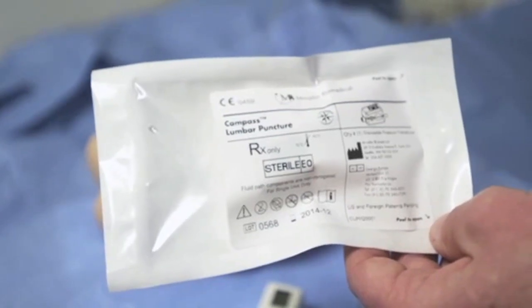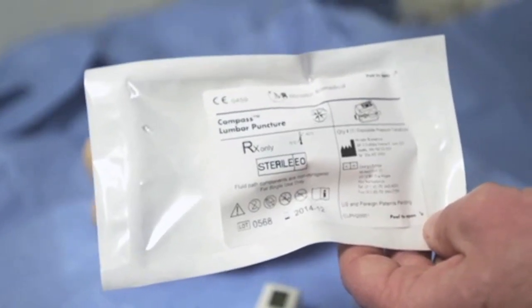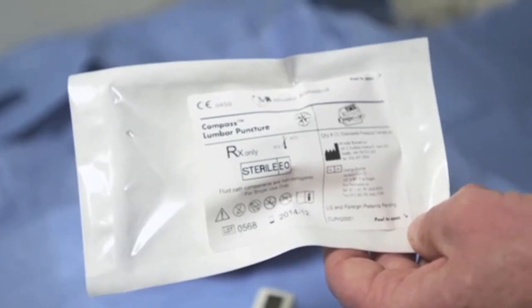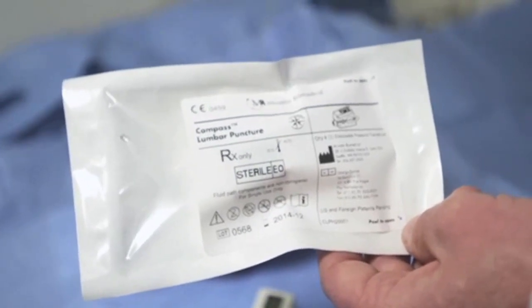This is a tutorial for the use of the Compass lumbar puncture device. The Compass is a single-use sterile pressure transducer that can be used to obtain opening pressure during lumbar punctures.